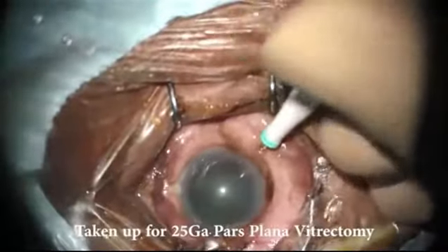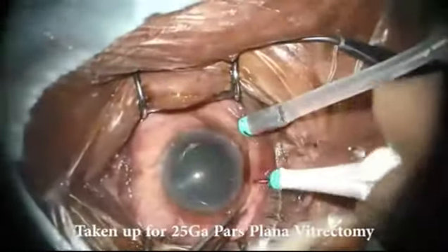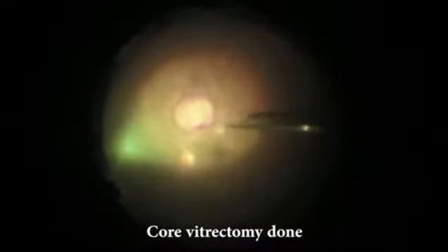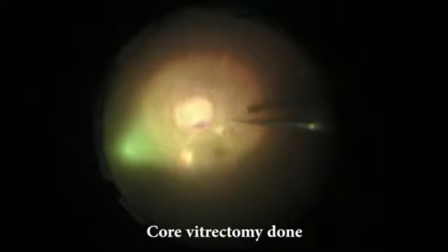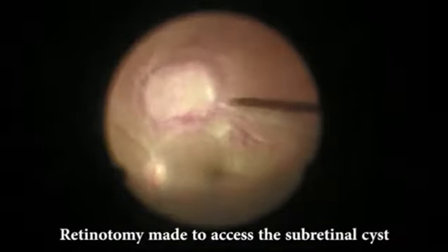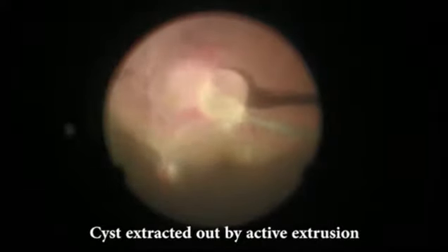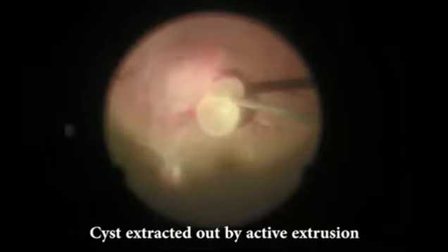cysticercosis. The patient was taken up for a transconjunctival 25-gauge 3-port pars plana vitrectomy. A core vitrectomy was done with the removal of vitreous around the lesion. A small retinotomy was made near the edge of the lesion to access the subretinal cyst. Active extrusion was used to suck the cyst out of the retinotomy. Due to the compressible nature of these cysts, they can usually be removed through very small retinotomies.